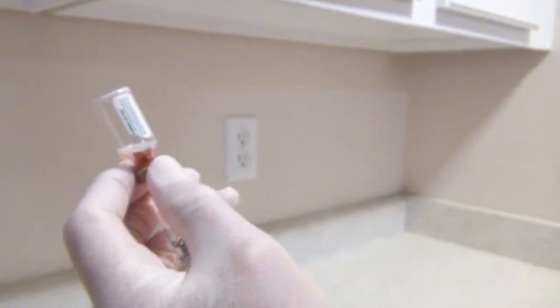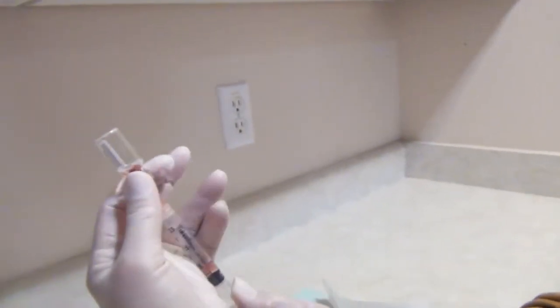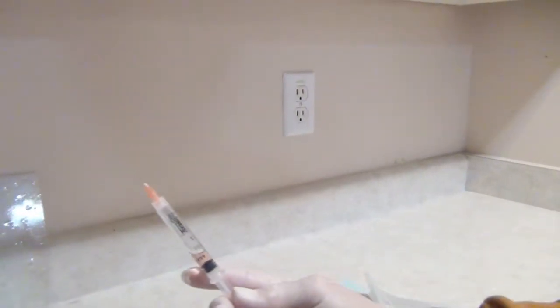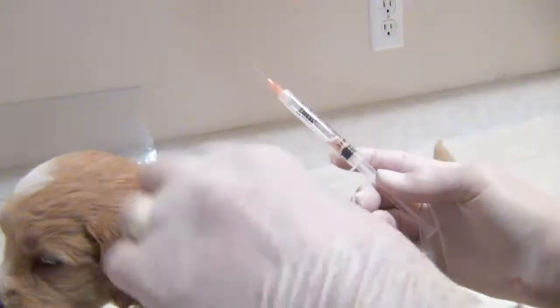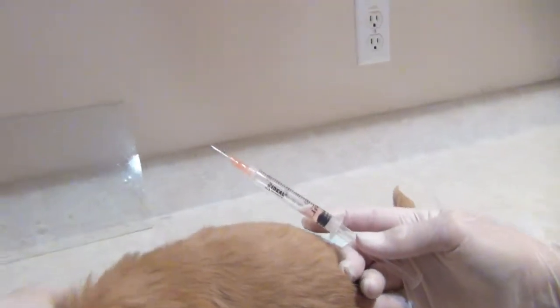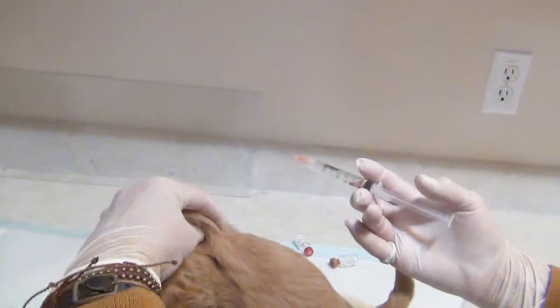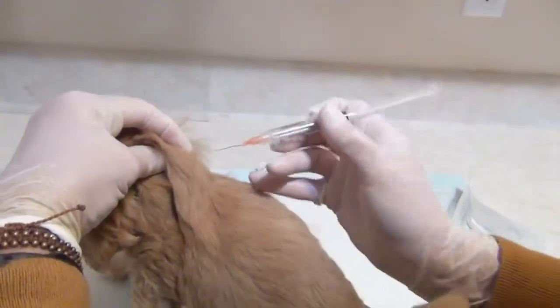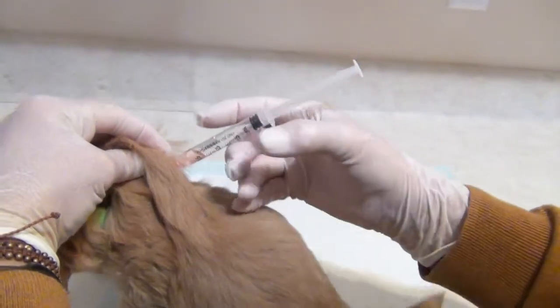Draw the entire amount up into the syringe. And then simply, here is the easiest, best way to do a scruff. Pinch with your first and third fingers, and instead of just poking into that little scruff, use your index finger to make a little tent so that you can come underneath and go directly in. There's a space that you've made there with the little tent.